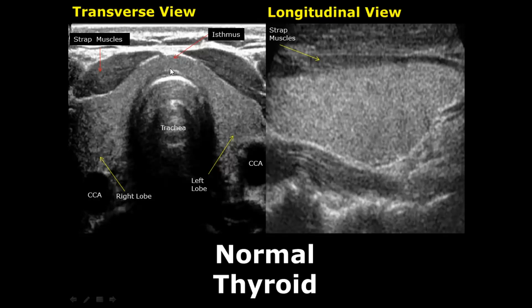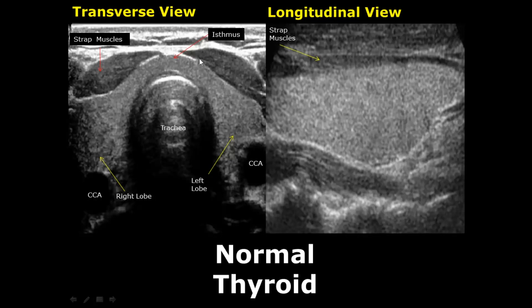The thyroid gland is located in the neck region. It is divided into two lobes — the right lobe and the left lobe — and these two lobes are connected together through the isthmus. The thyroid has a hyperechoic appearance. The trachea is visible here, having shadows due to the presence of air, and anterior to the thyroid are the strap muscles.